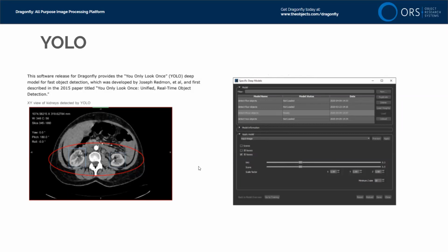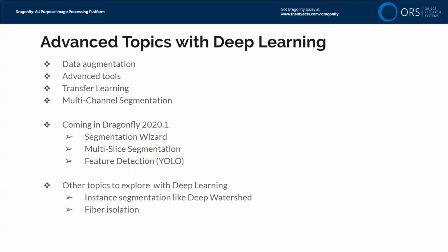And we've done that where we have, for example, done 3D boxing of kidneys in abdominal CT scans. It doesn't require as much training data as you would think, and the training data, of course, here is boxes. It is not the labeled pixels. So that covers everything I want to talk about.